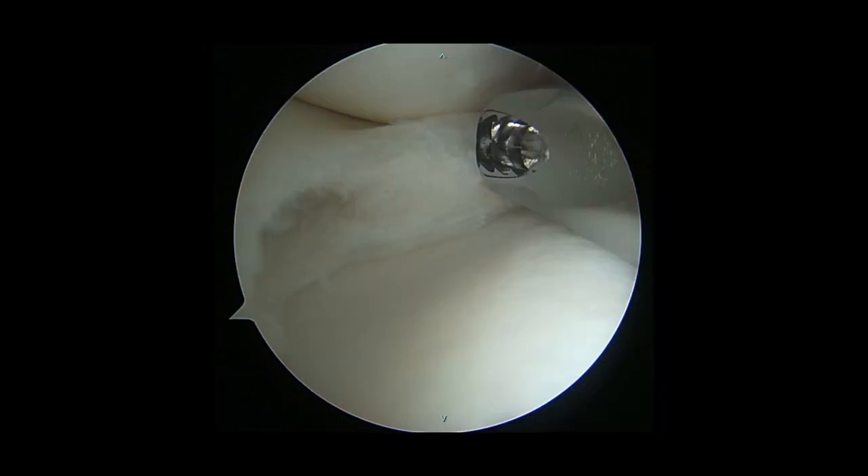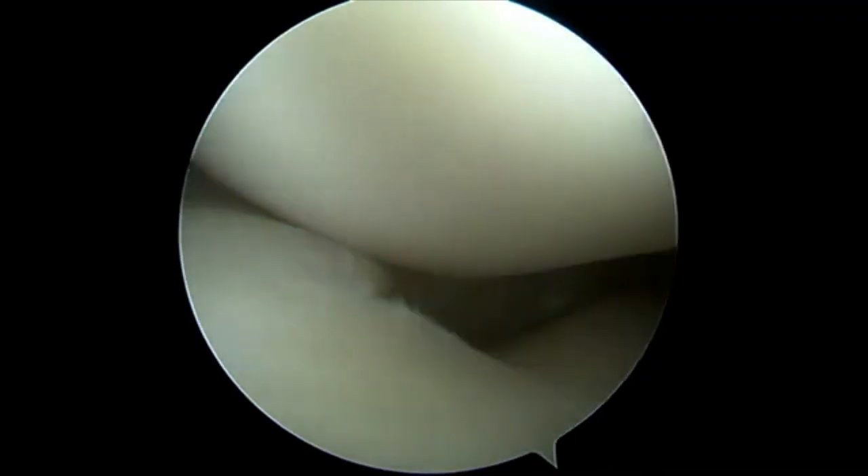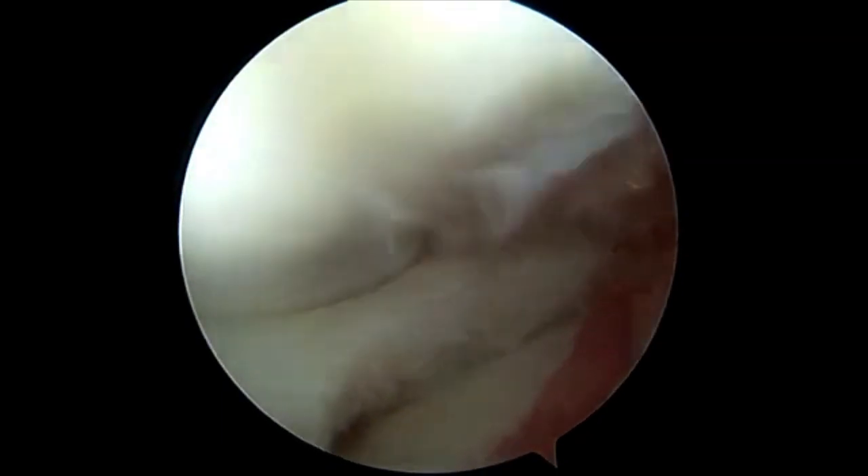Upon completion of the diagnostic arthroscopy, an arthroscopic punch and shaver were used to saucerize the meniscus to normal anatomic dimensions. Six to eight millimeters of stable rim was preserved. After the saucerization was complete, the stability of the meniscus was assessed once more. As shown here, the meniscus continued to subluxate anteriorly when the knee was flexed.